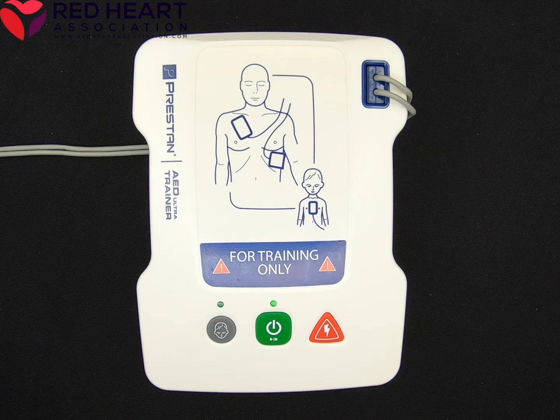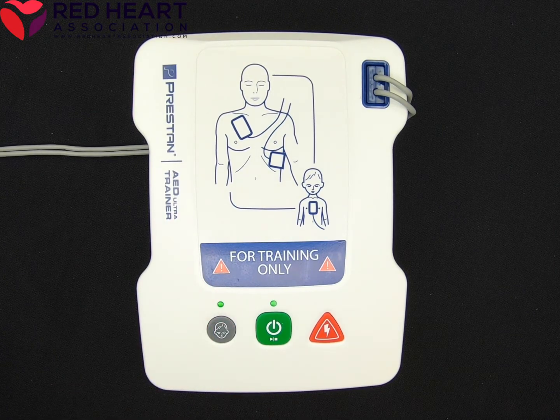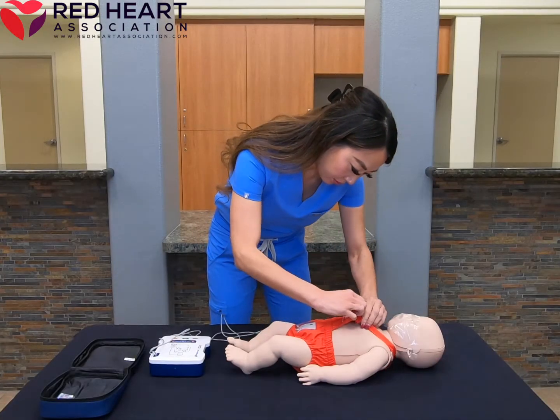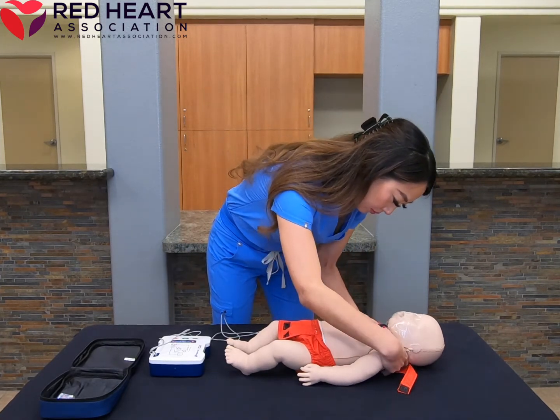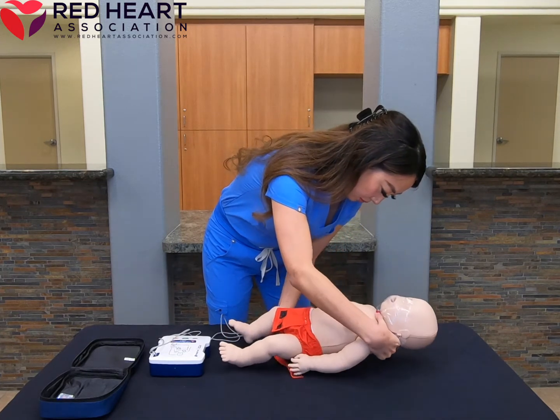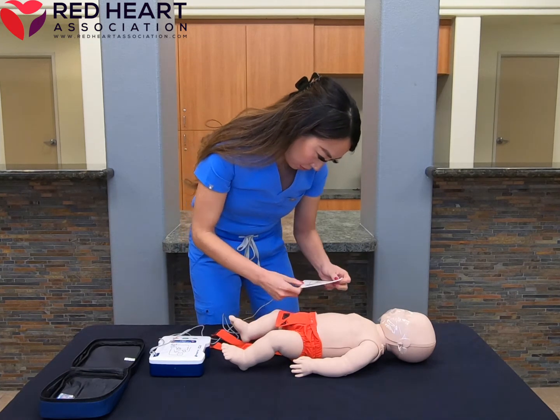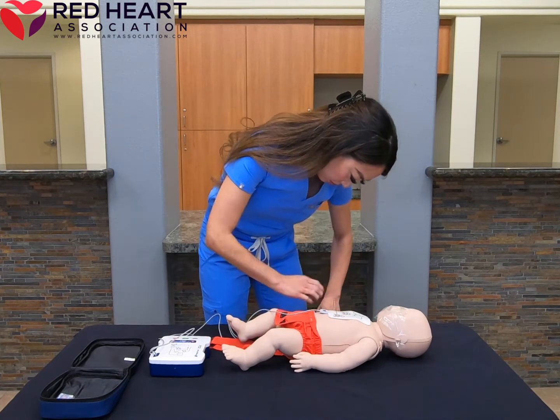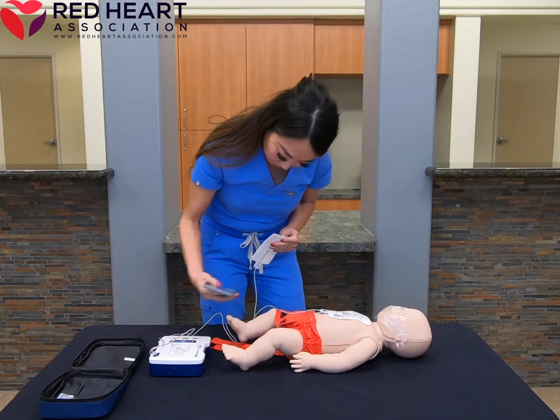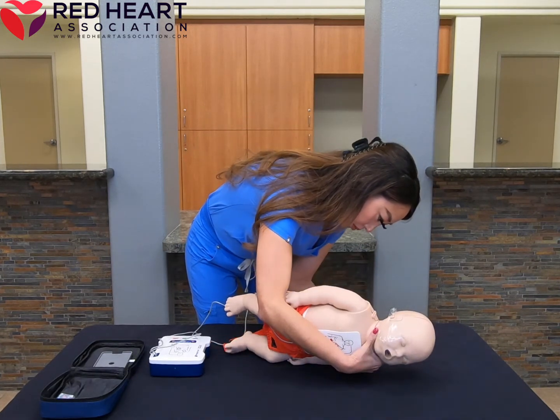Adult patient. If the patient is a child, press the child button. Child patient. Remove the child's shirt. Remove packet and apply pads onto child's bare skin. Apply pads to child's back and chest as shown in the pictures. Press pads firmly on skin.